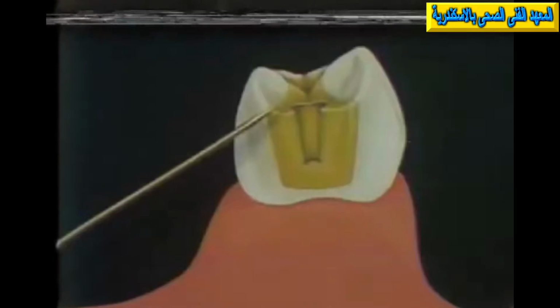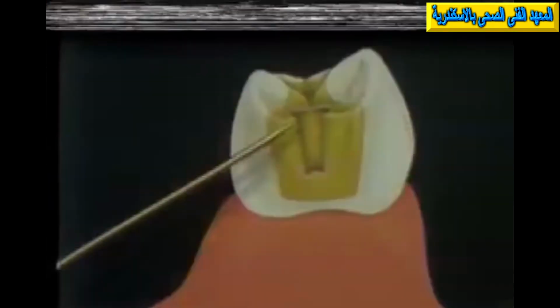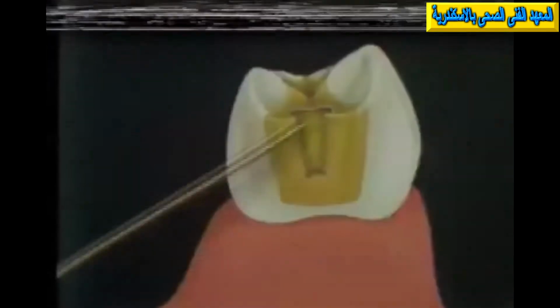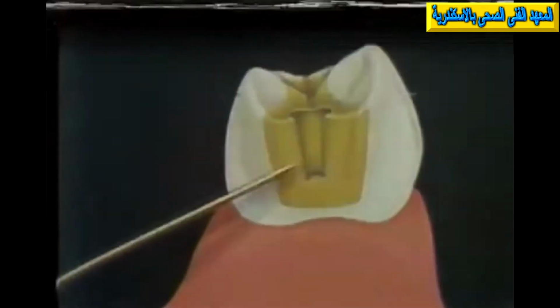But first of all, let's take a look at the diagram over here, which shows an enlarged view of the keyway of the semi-rigid connector. And we'll discuss this in greater detail at a later point. But I think you can recognize here the retentive key form, the fact that it's about twice as long as it is wide, and that it tapers from occlusal toward the cervical, and has here been cut in a class 2 inlay on this tooth.